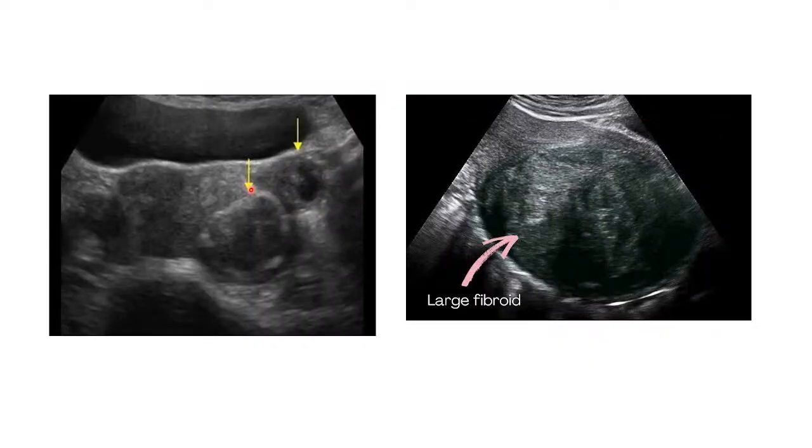So now, again, here you can see that we are having a fibroid, this lesion there. It has got bright margins. So this is in keeping with a calcifying fibroid. So this fibroid is sort of calcified. If you look at the uterus here, the uterus itself has got issues.